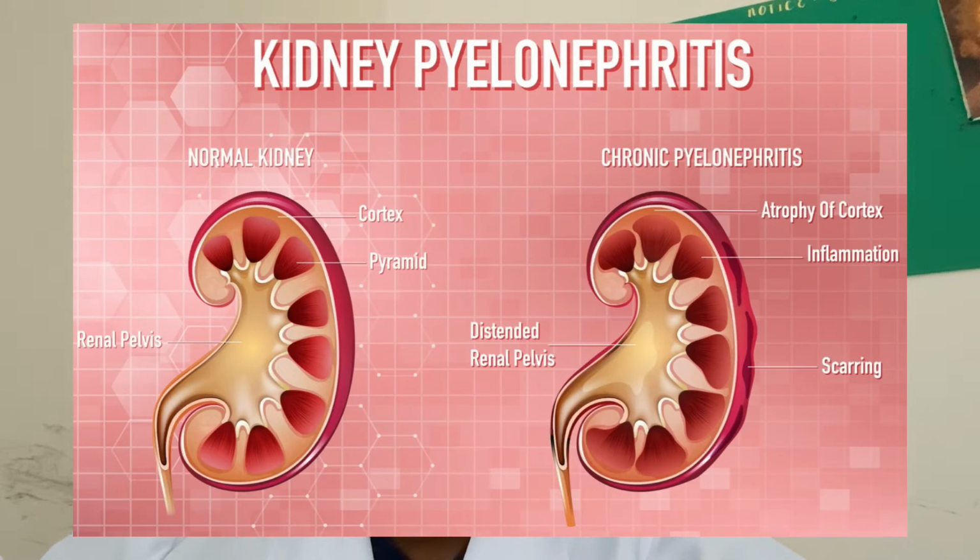We also have to take a look at the infection risk and wound care, where patients with nephrostomy are always at risk for pyelonephritis, which is inflammation of the kidney, and it is usually due to infection from the foreign body puncturing the kidney. They should be often monitored for signs of infection or sepsis, for instance, loin pain, elevated temperature, fever, or chills. Drainage bags should be changed every 5 to 7 days, while good hand hygiene is vital when handling the drain and exit site and emptying the drainage bag.